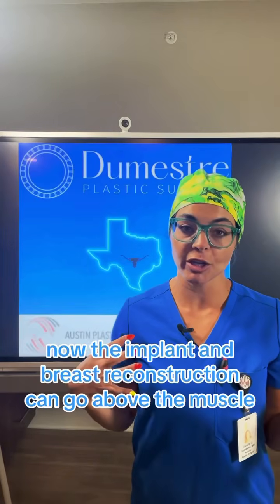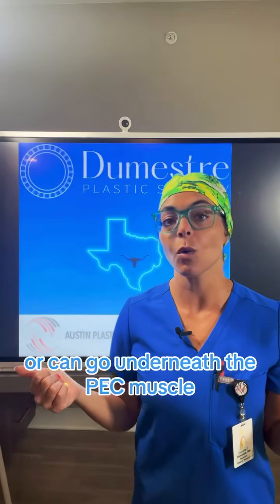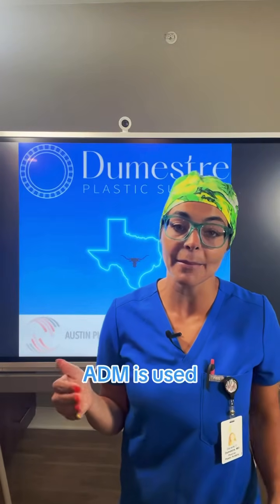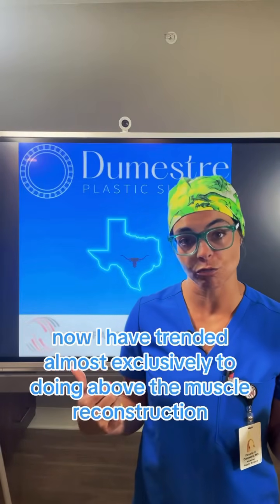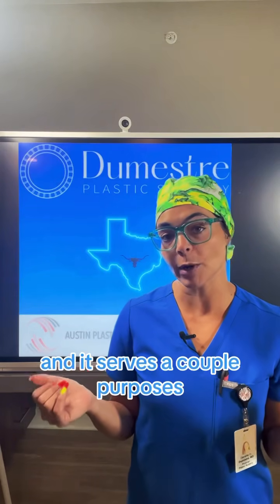Now, the implant in breast reconstruction can go above the muscle, that's the pec major muscle, which is called prepectoral reconstruction, or it can go underneath the pec muscle, subpectoral reconstruction. In both cases, ADM is used. Now, I have trended almost exclusively to doing above the muscle reconstruction, and indeed I use ADM for all of those patients. And it serves a couple purposes.